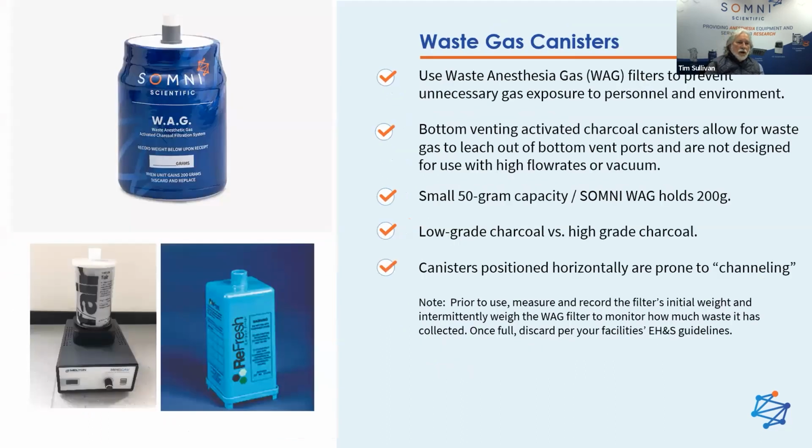Next, we're going to talk about the waste gas canisters. All waste gas canisters are not created equal. There's some design flaws in a lot of these waste gas canisters. One of the biggest flaws is a lot of them vent out the bottom.